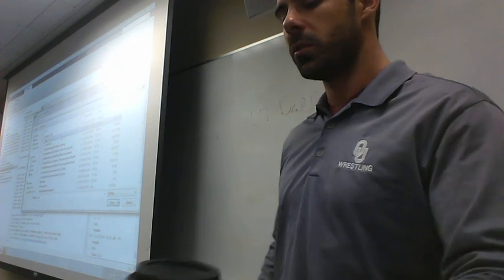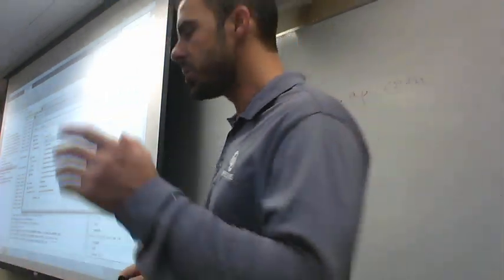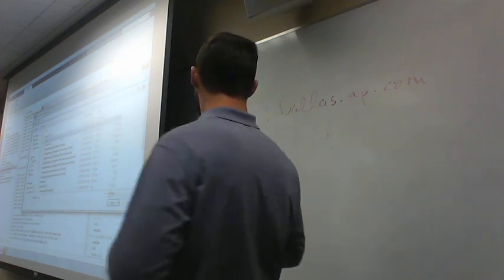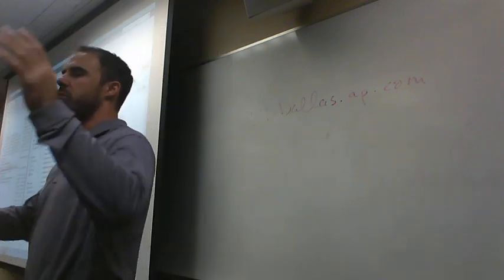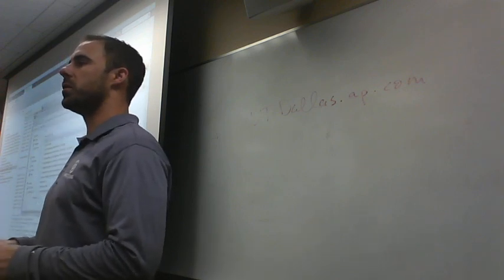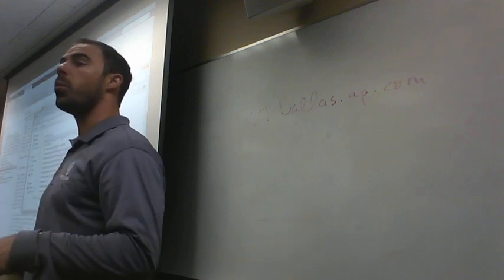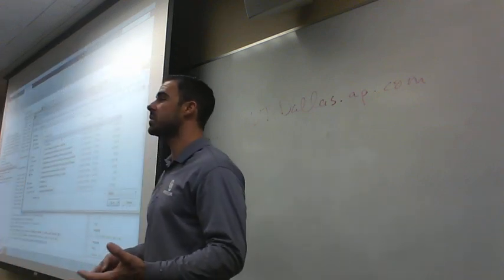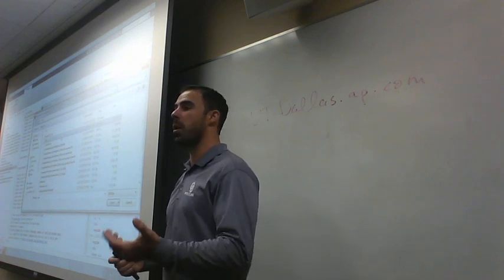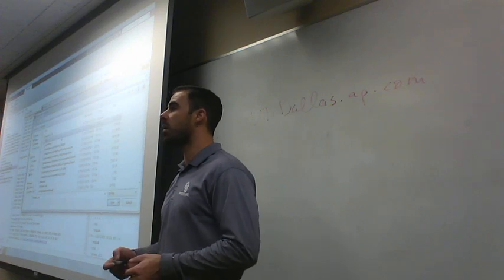Well, this is a really good question. There's always going to be this one, or there will be other ones. We're just doing that one today, and here's why. I'm going to use our walkthrough of the data to introduce you to what the experiment is, what the experimental setup is, and how it's organized. When we talk about that, it's going to give us an opportunity to gain some insight into the issues at hand about memory that we're actually studying, and how we're doing that with experimental design and all those types of things.